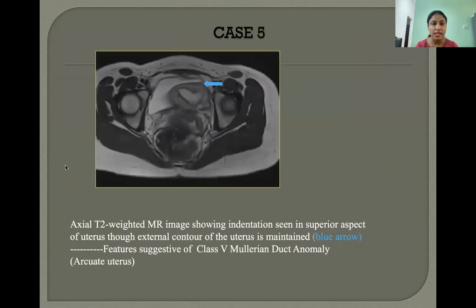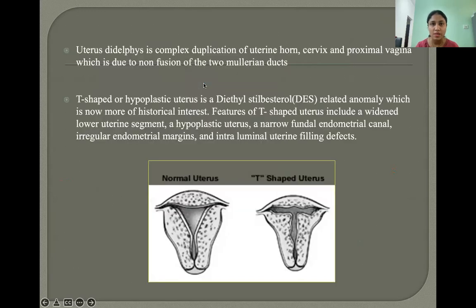Case 5: Axial T2 weighted MR image shows an indentation seen in the superior aspect of the uterus, though the external fundal contour is maintained. These features are suggestive of class 6 Mullerian duct anomaly, arcuate uterus.